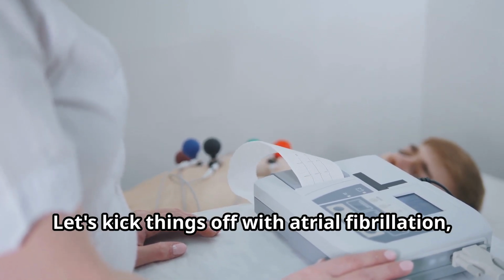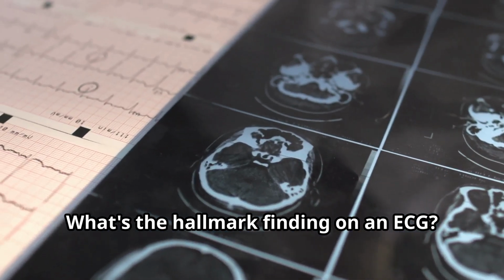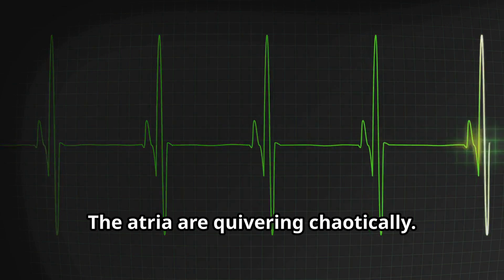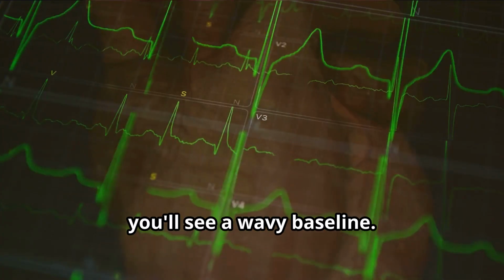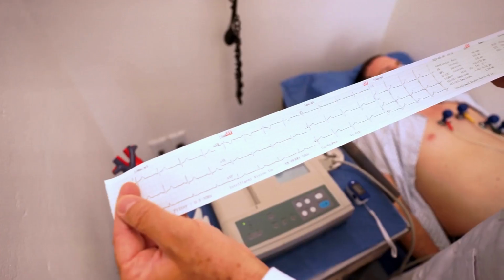Let's kick things off with atrial fibrillation, or AFib. What's the hallmark finding on an ECG? An irregularly irregular rhythm and no distinct P waves. The atria are quivering chaotically. This chaotic activity makes the rhythm irregular. You won't see organized P waves, instead you'll see a wavy baseline. Once you recognize it, AFib becomes clear.